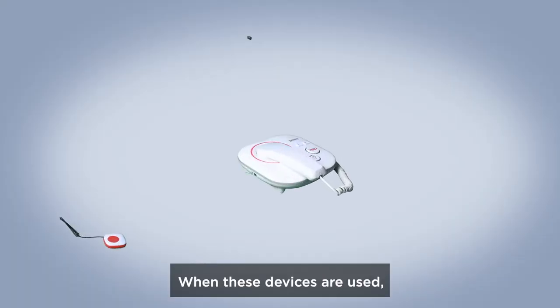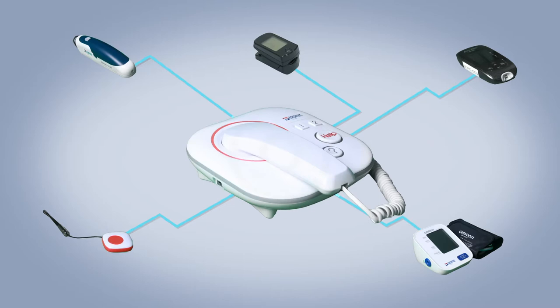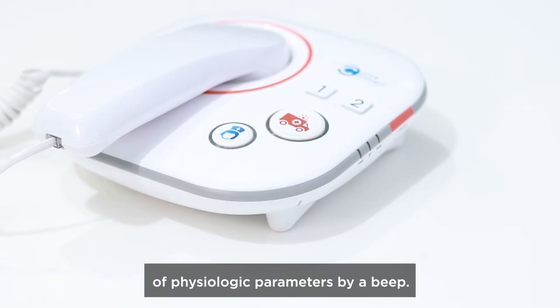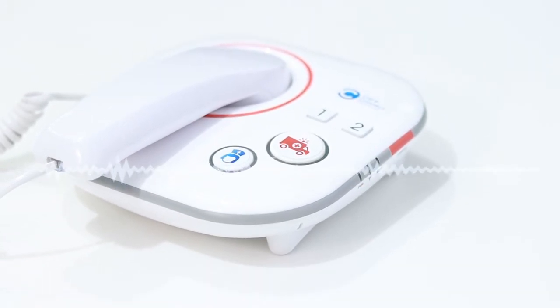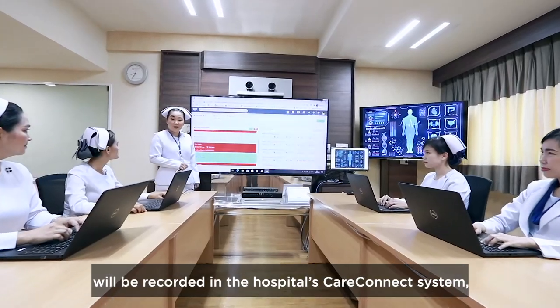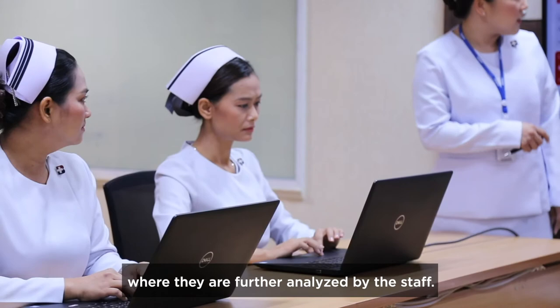When these devices are used, physiologic parameters will be transmitted to the base unit. The base unit will confirm the receipt of physiologic parameters — Bluetooth measure completed. At the same time, your physiologic parameters will be recorded in the hospital's CareConnect system, where they are further analyzed by the staff.